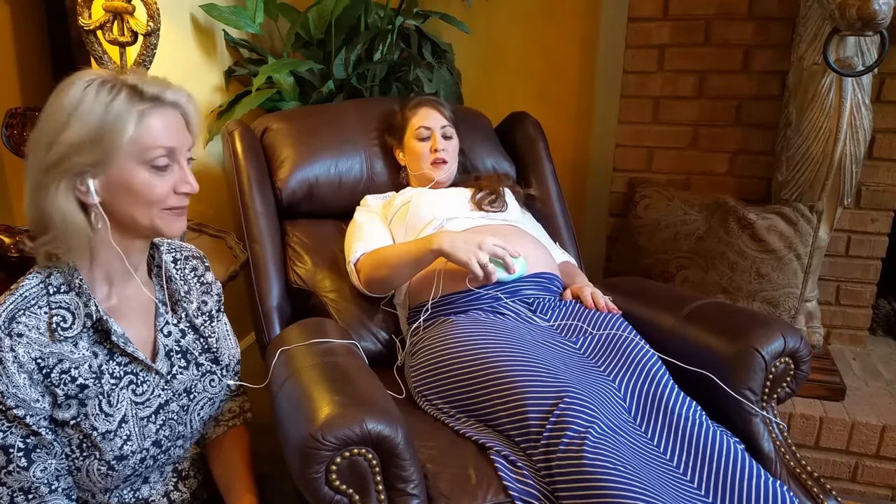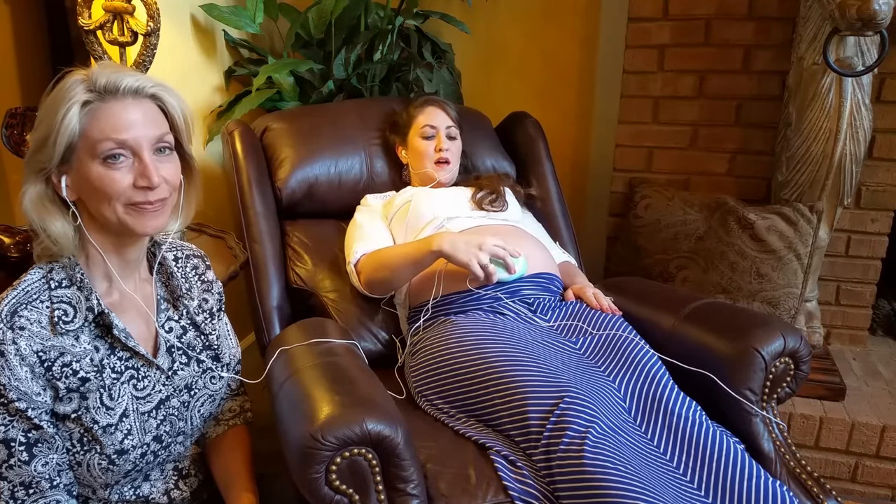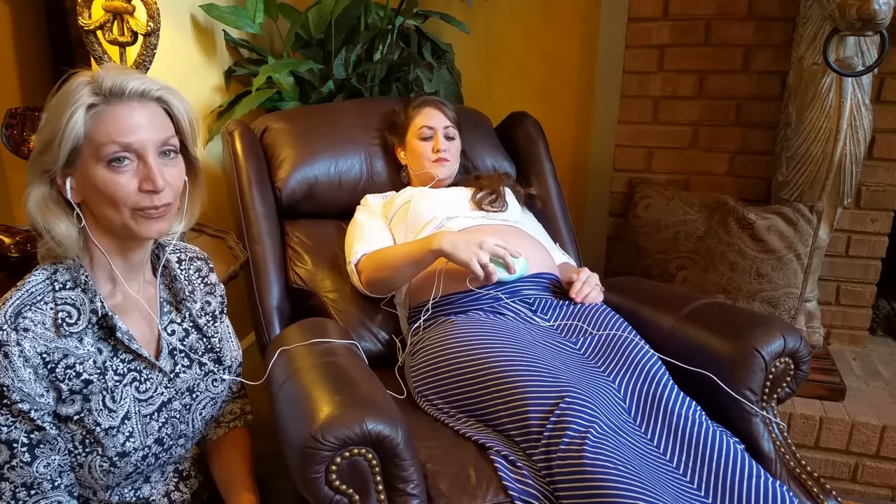Know that before 16 weeks of pregnancy you might not always hear it. I did use the monitor on my sister this past weekend who is nine weeks along, and we were able to find the baby's heartbeat. Know that it is typically lower and quieter as well.